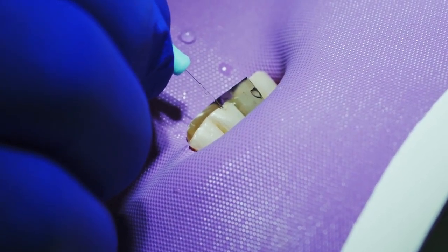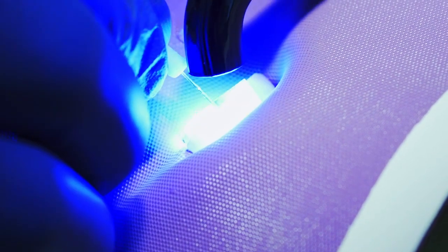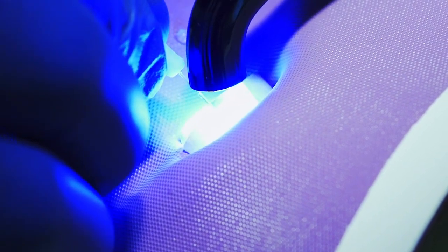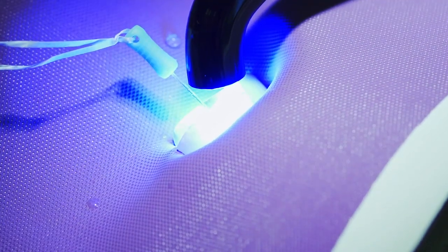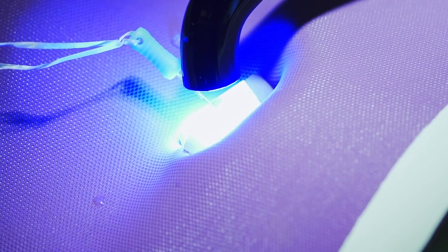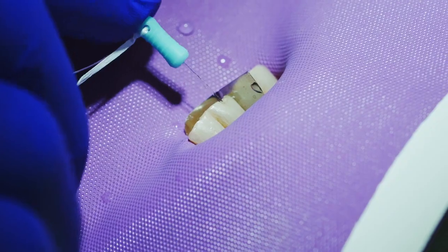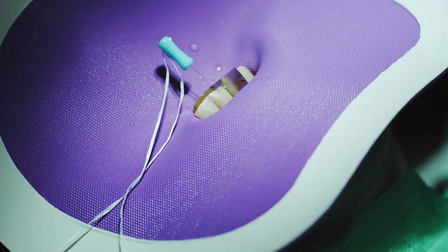Then we'll cure it. One of the advantages of this fiber optic fiber is it takes the light and transmits it to the base of the preparation, so the curing depth is deeper as well. Now the glass pin is inserted into the tooth.